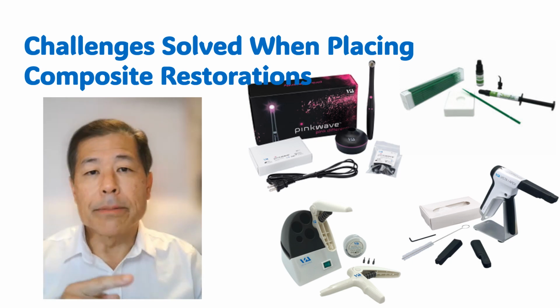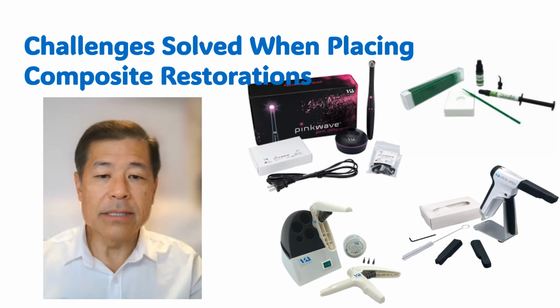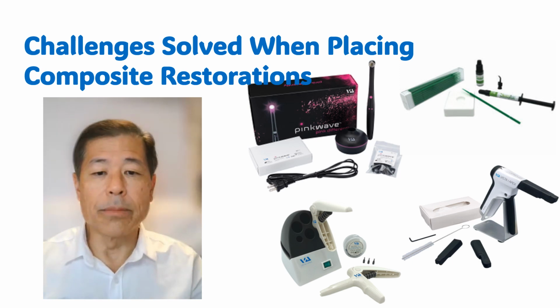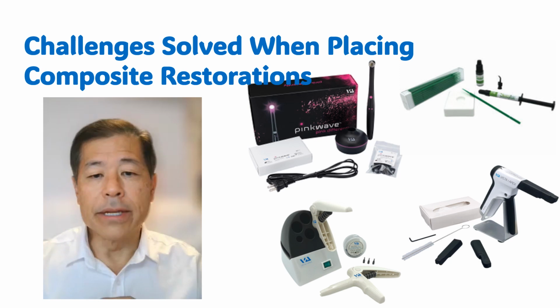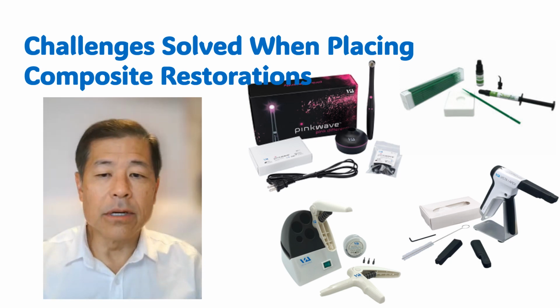So with the benchtop composite warmer that you see over here, that just sits on our bench. We have compules of our composites sitting in there, and they're just ready to go. Or you could put your syringe composite in there. You can even put your local anesthetic in there to warm it up, and you see the composite gun just fits into a little opening. So that's very convenient, and everything's ready to go.